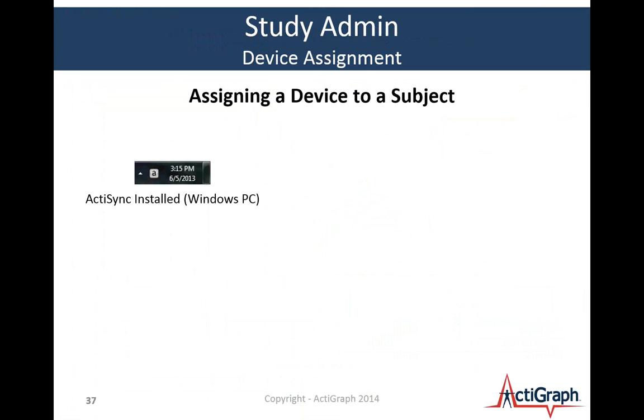And yes, I'll get this question, does it run on a Mac? Not yet. It will by the end of the year. It will run flawlessly in Parallels if you're running a Mac. Once that application is installed, it basically just sits on your computer looking for a device to be connected. So someone comes into a clinic to get an activity monitor. The activity monitor is connected to the computer.